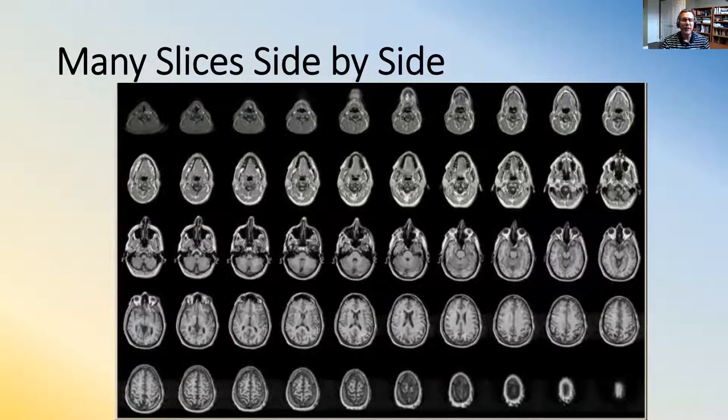It's a very valuable and highly skilled profession. It takes years of experience to understand what you're looking at in an image like this. But for a head doctor, they can look at this MR and see all the various slices side by side. And when they look at all of them, that builds up a three-dimensional map in their mind. But anytime they want, they can zoom in.